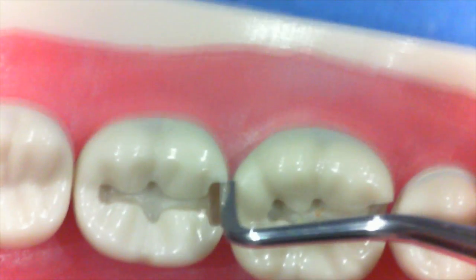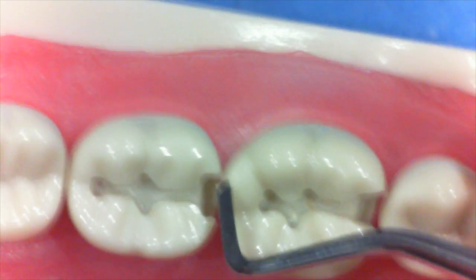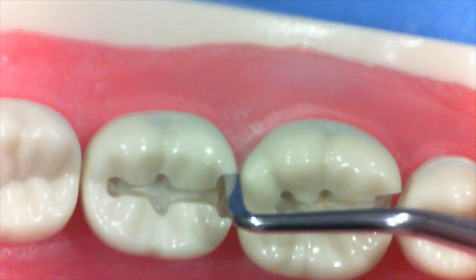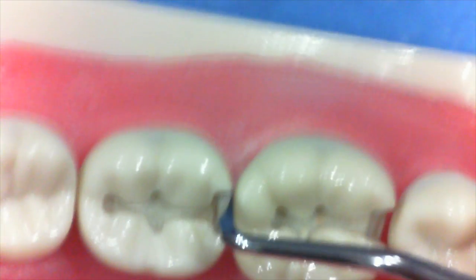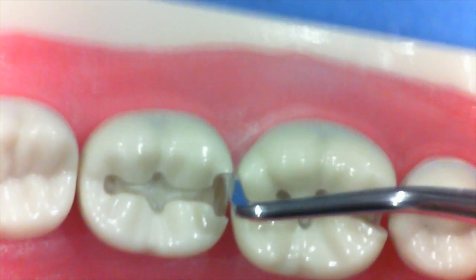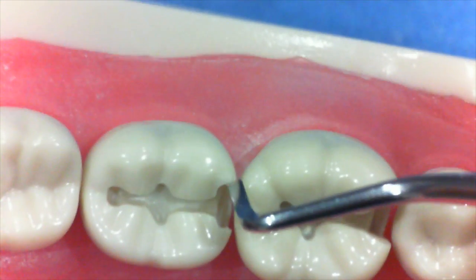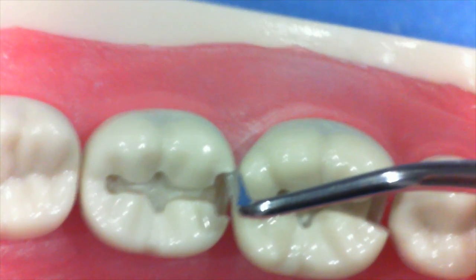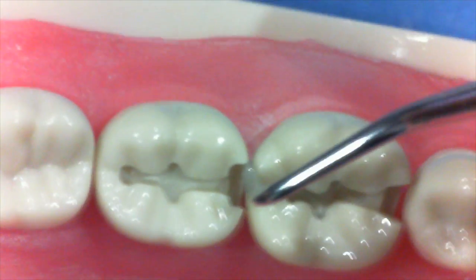We can then use a 10-7-14 enamel hatchet by having the hatchet facing away from the wall — the bevel is not facing the wall in which you're trying to smooth. These undermining areas can easily be chopped off with a sharp hatchet. You need to be careful to orient the hatchet at 90 degrees relative to a tangent of the exit angle.